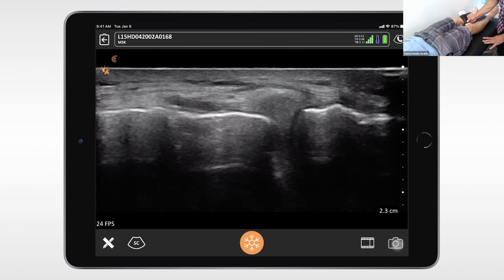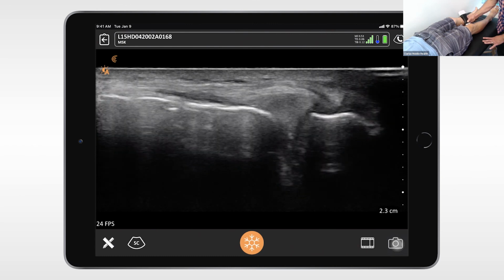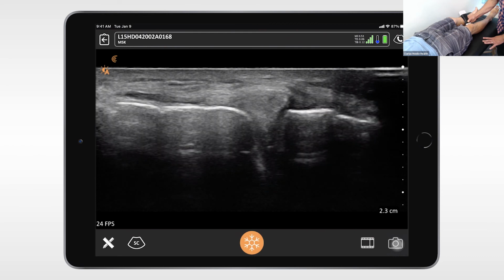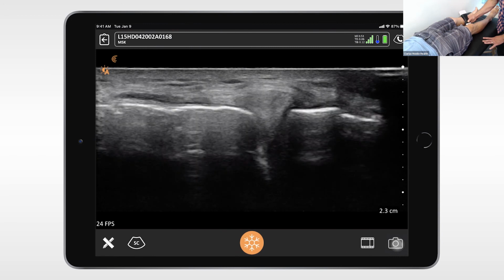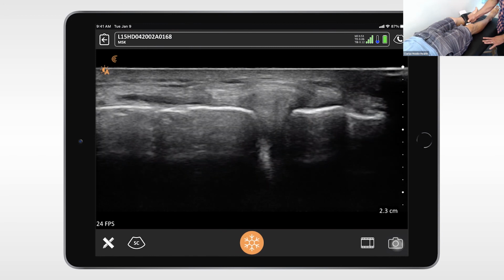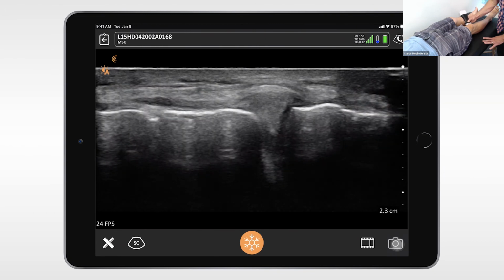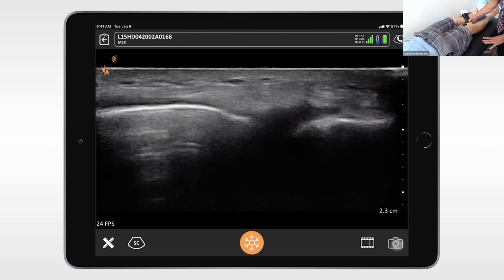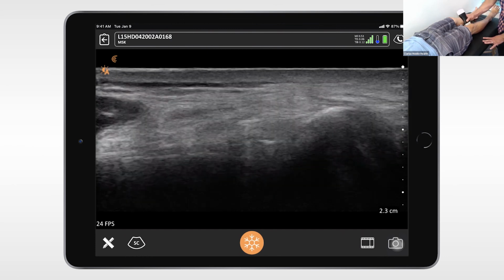And now in this specific image we're seeing right now, you can see beautifully the deep part of the meniscofemoral ligament, the deep part of the medial collateral ligament complex. It's the hyperechoic ligament running from the meniscus towards the left of the screen on top of the hyperechoic bone. So this is beautiful to see, and he looks like having a great meniscus. So yeah, okay, he'll be happy to hear that.